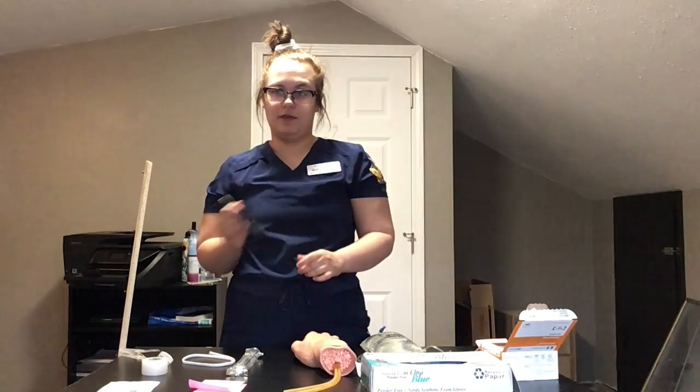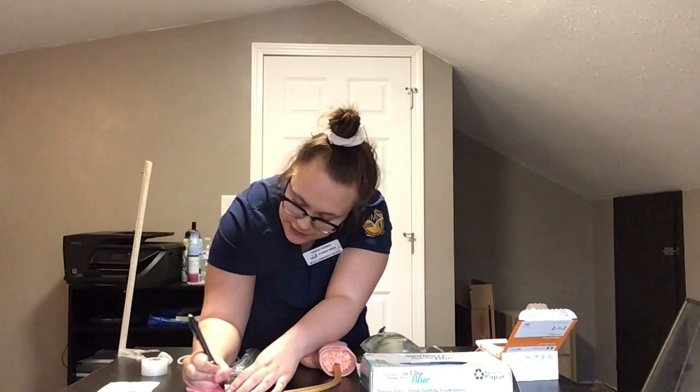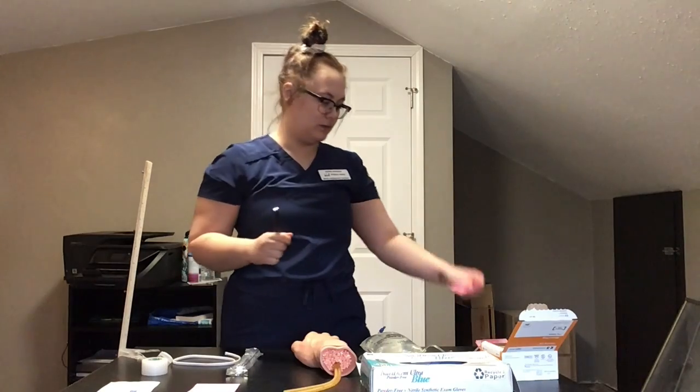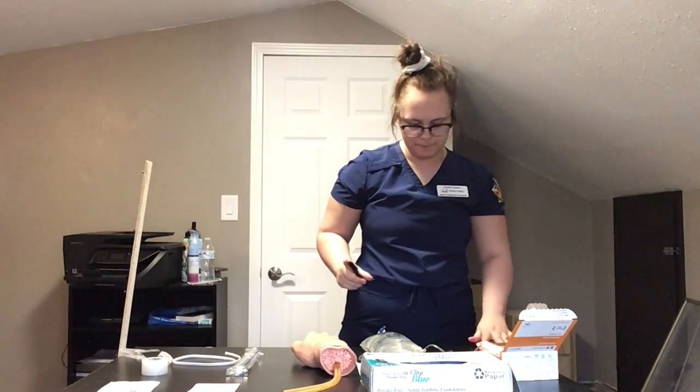And then I'm going to get a label for my tubing. That would have the date and the time. And I would put that on the tubing, but I'm just going to put that over here.